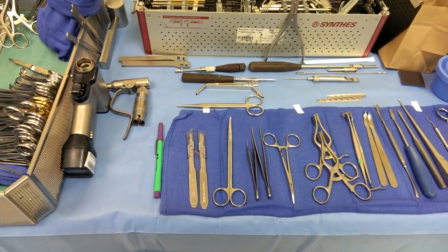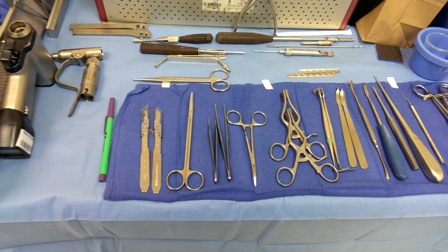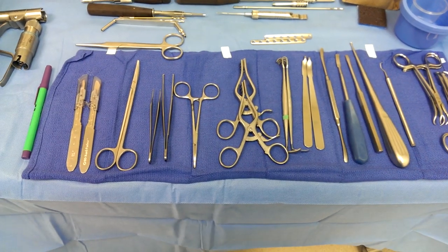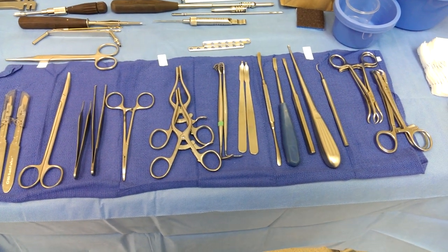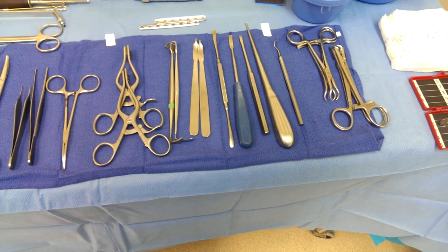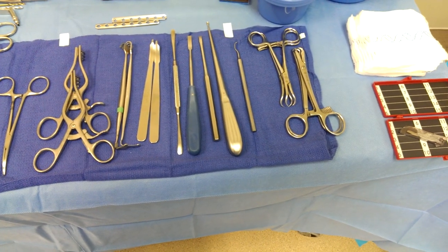I usually have my drill ready. Knives, scissors, pick-up, clamp, retractors. We have your Senn retractors and your Weitlaners, baby Hohmanns, freer elevator and key elevators, curette. And we have the dental pick and the reduction clamps to fix the fracture.